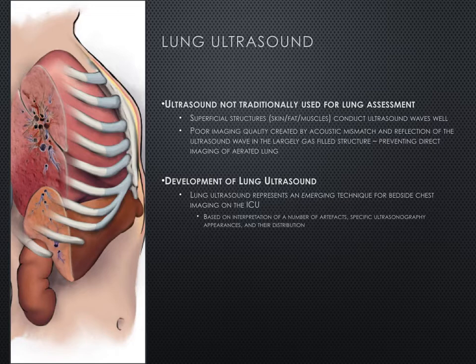However, in the development of lung ultrasound as an imaging technique from an acute care perspective, lung ultrasound itself is based on interpretation of a number of these artifact patterns and appearances within the aerated and non-aerated lung itself.